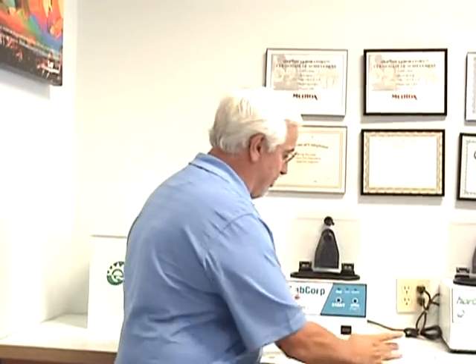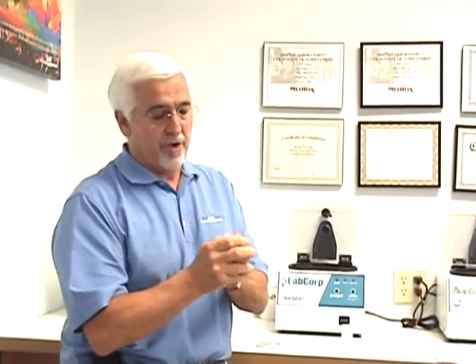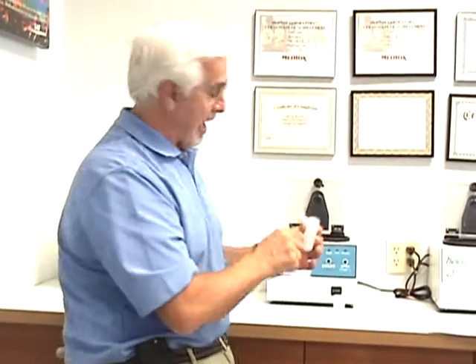You can actually hear the piece coming off. We do the transfer. Now, this is important for somebody who's the subject or the donor of a drug test. At this point, when the urine is there and this is happening, you don't ever want to let your eyes leave sight of your urine or the test kit, because this is where, if somebody was going to adulterate your sample, they'd have the opportunity to do it, and you don't want to let that happen. So always stay right there and watch this happen.